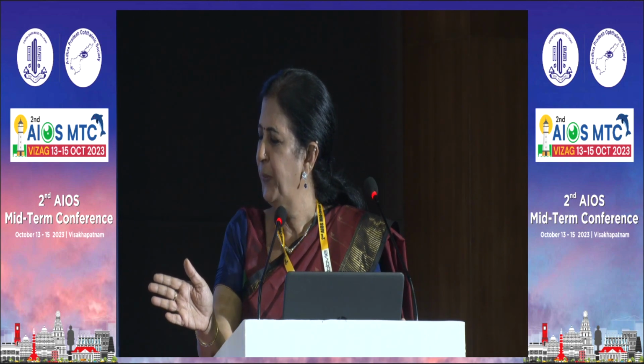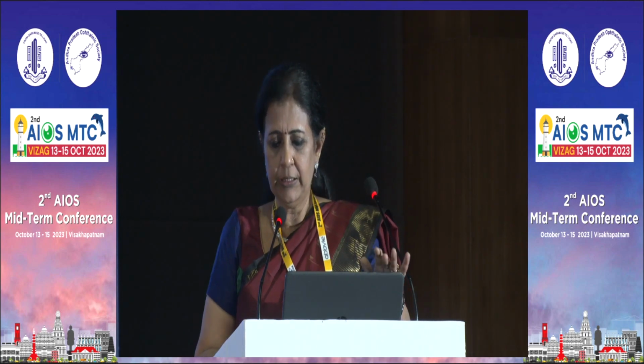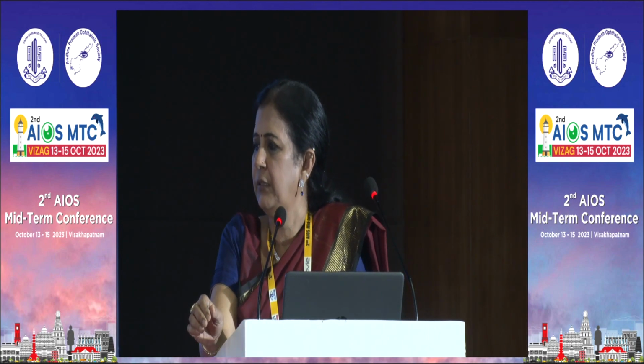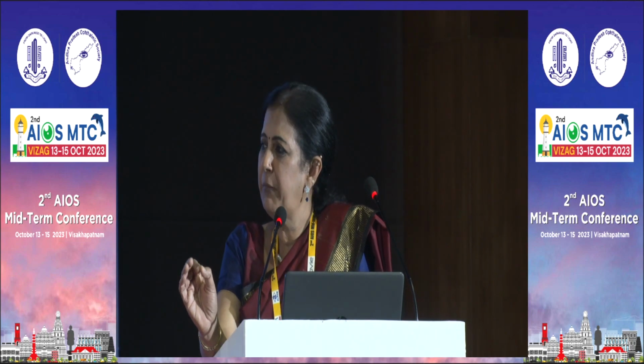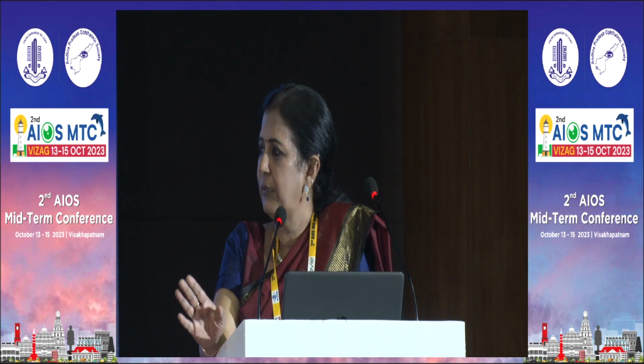My question was, say it's a 22.5 diopters and it leaves a plus 0.21 as a spherical equivalence, which is what we normally choose for a cataract patient. But for a moderate myopia vis-a-vis a moderate hyperopia, if you're doing a clear lens extraction, I would like to leave him a little myopic if at all, rather than go onto the hyperopic side. So that's for the myopic patient?